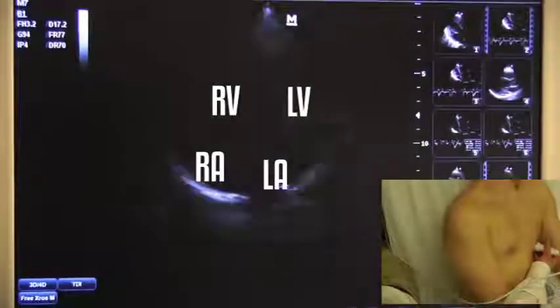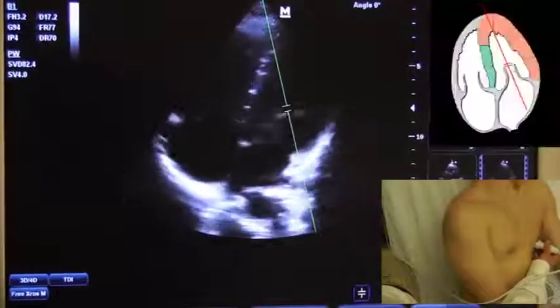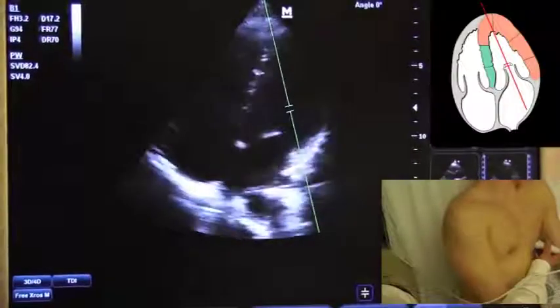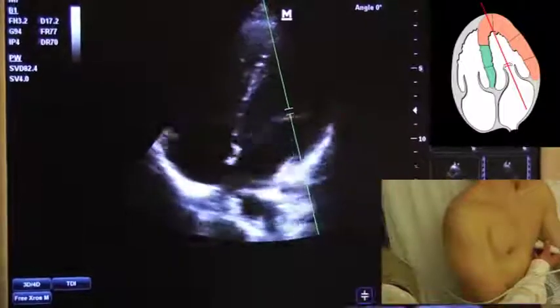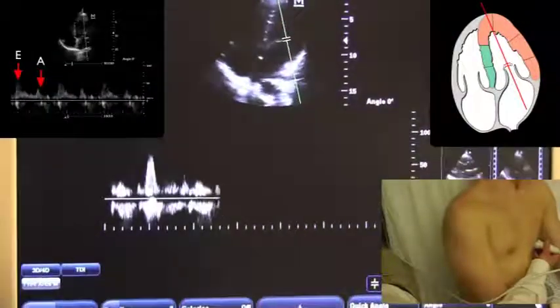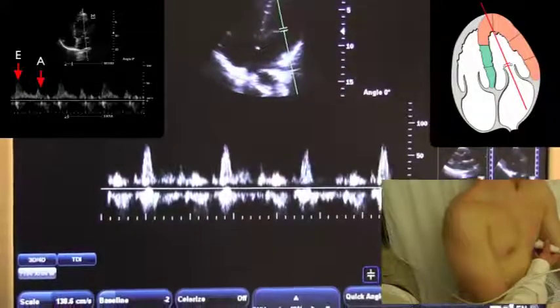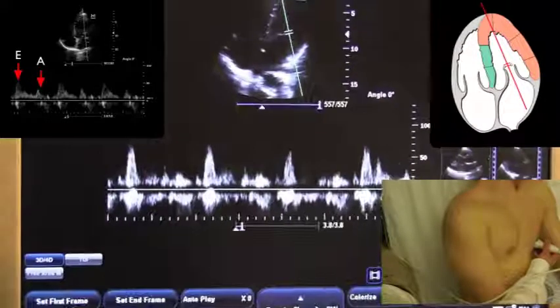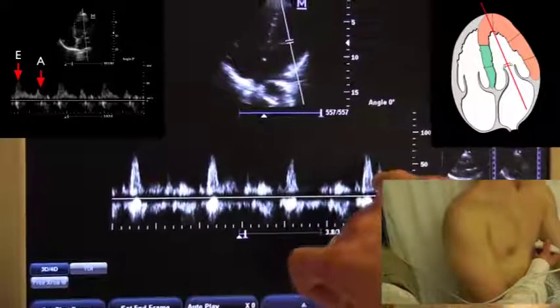I need the pulse wave at the mitral valve and the tissue doppler of the mitral annulus from this view. We'll start by hitting the PW button, and I'll place the gate just at the tips of the mitral valve leaflets.